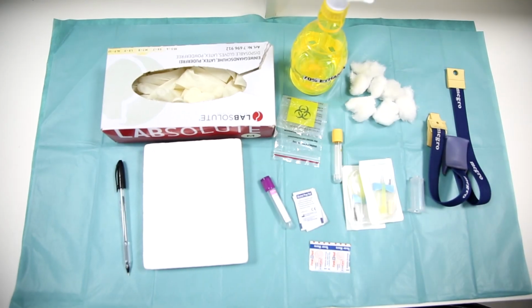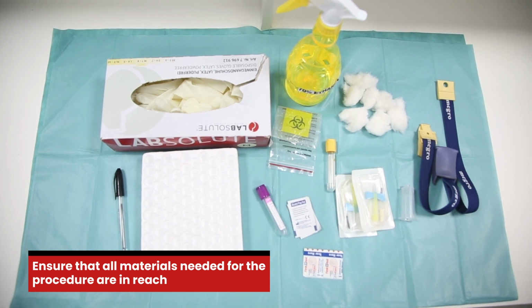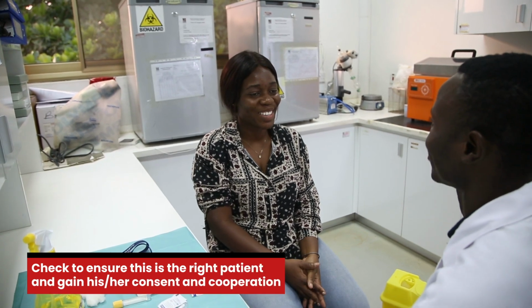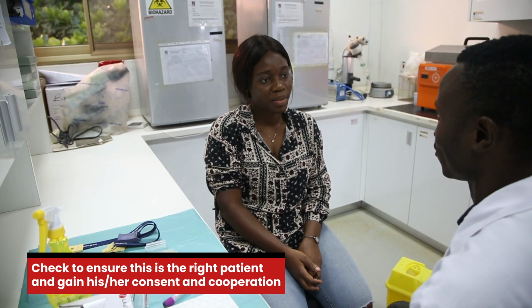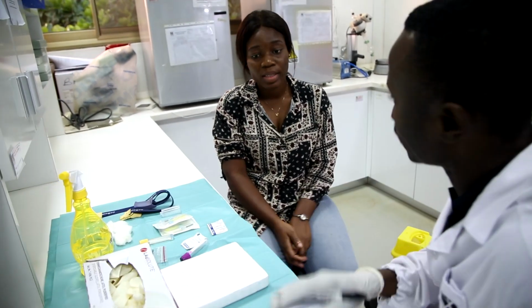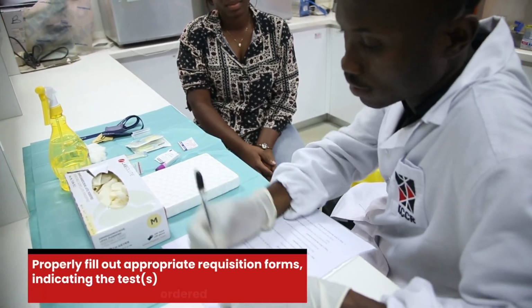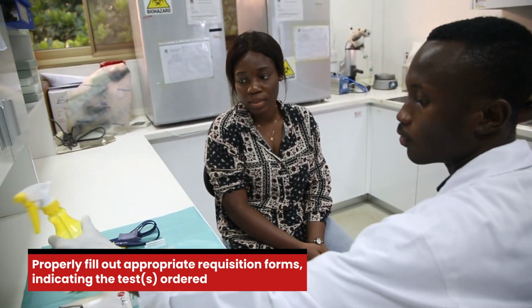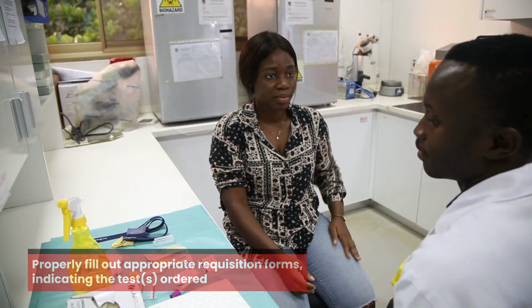The procedure. First, ensure that you have all materials needed for the procedure. Approach the patient in a friendly, calm manner. Introduce yourself to the patient and gain his or her consent and cooperation. Third, check to ensure this is the right patient for the test to be done. Properly fill out appropriate requisition forms indicating the tests that have been ordered.